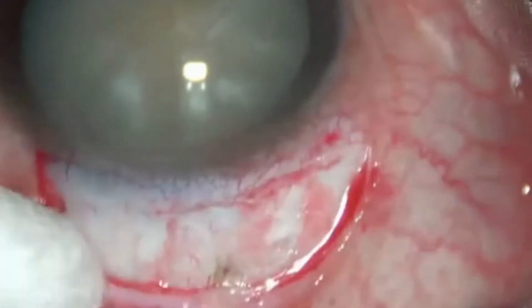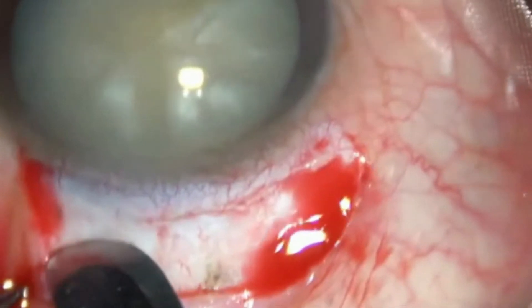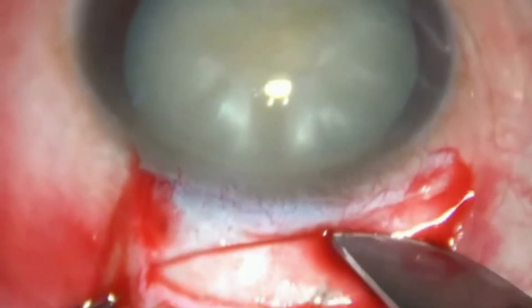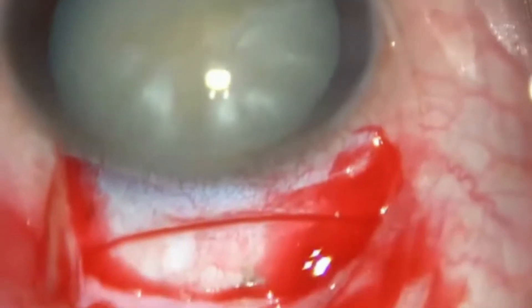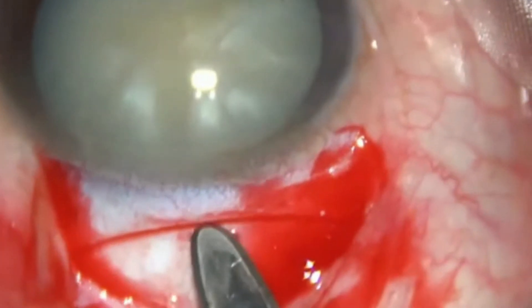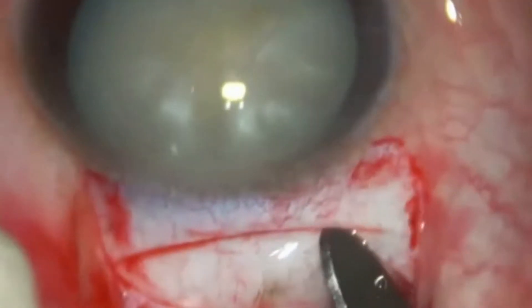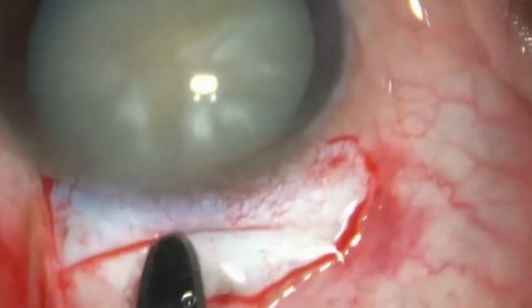The expected size and density of the nucleus should determine the size of the tunnel. For example, extraction of immature cataracts in younger patients may only require a small tunnel just large enough for the intraocular lens (IOL) optic to pass through. Very large, brown nuclei require a larger tunnel size and can sometimes be up to 8 millimeters in diameter and 4 millimeters thick.